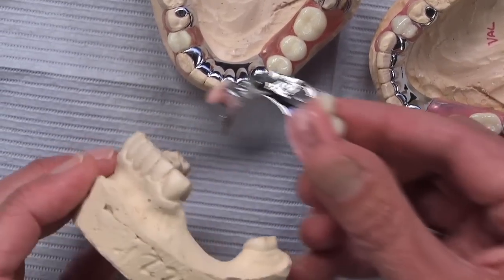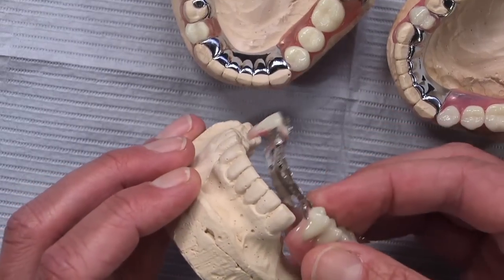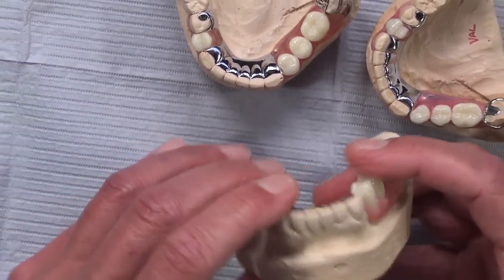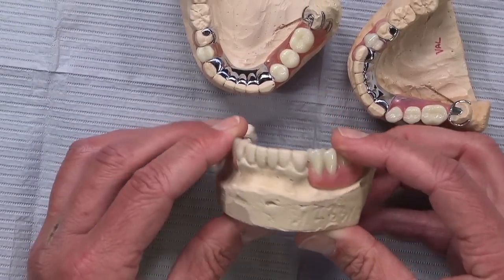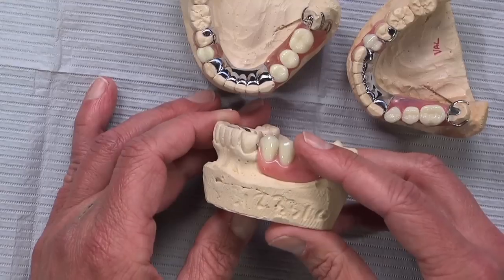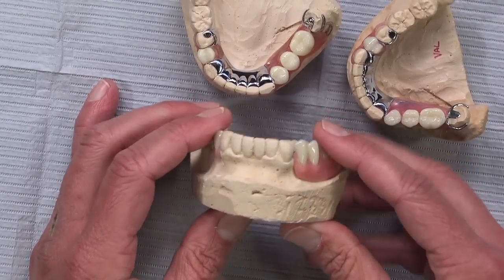So even though we have that clasp there that you see, when we seat this back down onto the model, you'll notice that it is an aesthetic clasp because it's not visible from the front. If you turn it way over to the side, of course, you can see that, but the cheek is always over there, and so that's not going to be a big deal.